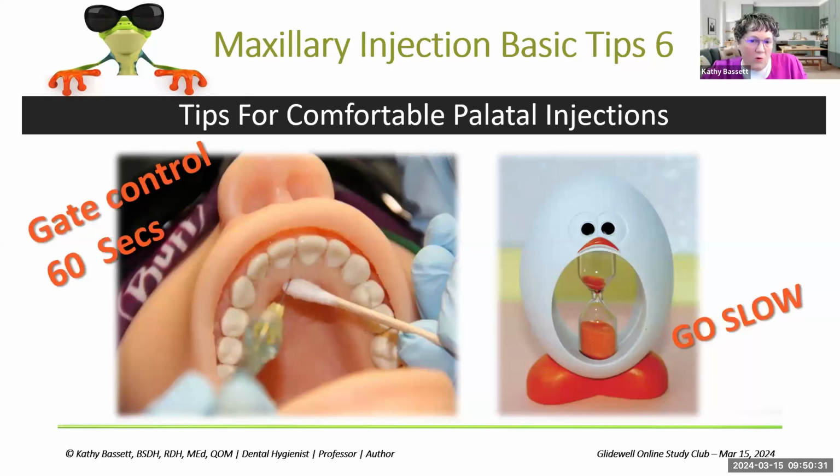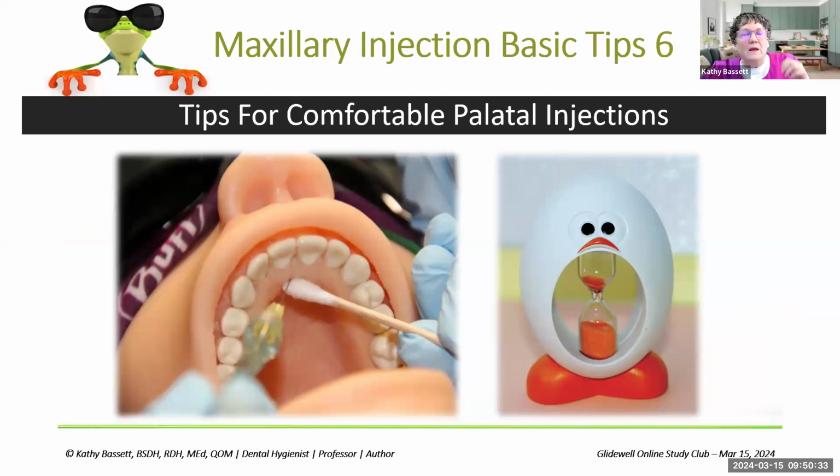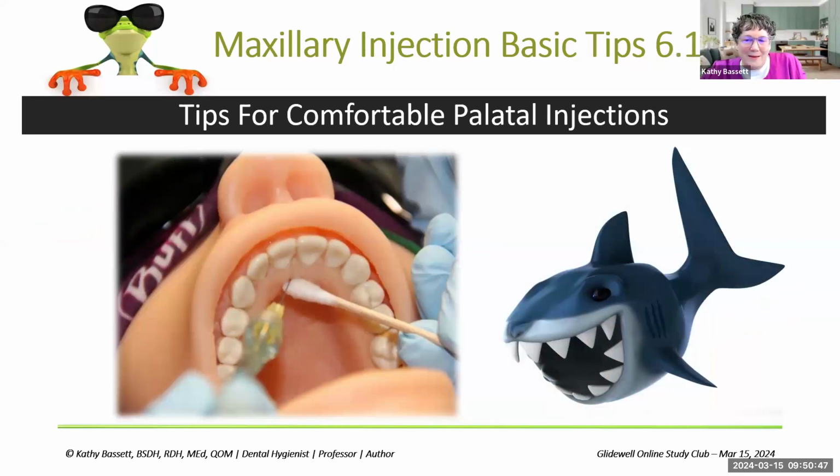So if we hold the pressure to a full minute, slow that down to about 3 minutes for palatal tissues for a whole cartridge, then we're going to have better pain management for those patients. And for me, that's a whole lot better than saying, oh, by the way, this is going to hurt a little bit, just hang on.